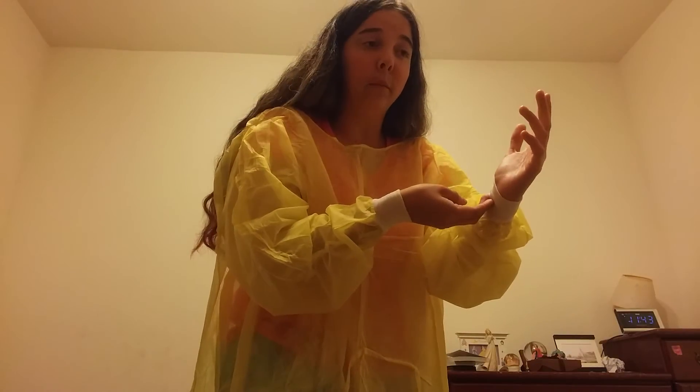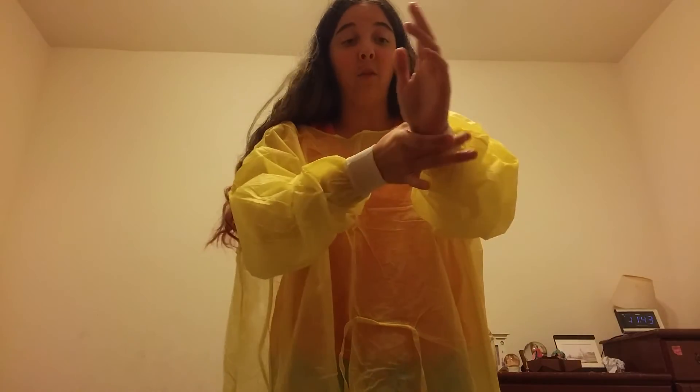To remove your glove, take your pointer finger and middle finger together, touch the outside of the glove, put your fingers underneath, and take it off, turning it inside out. Do the same to the other side and throw them away inside out.